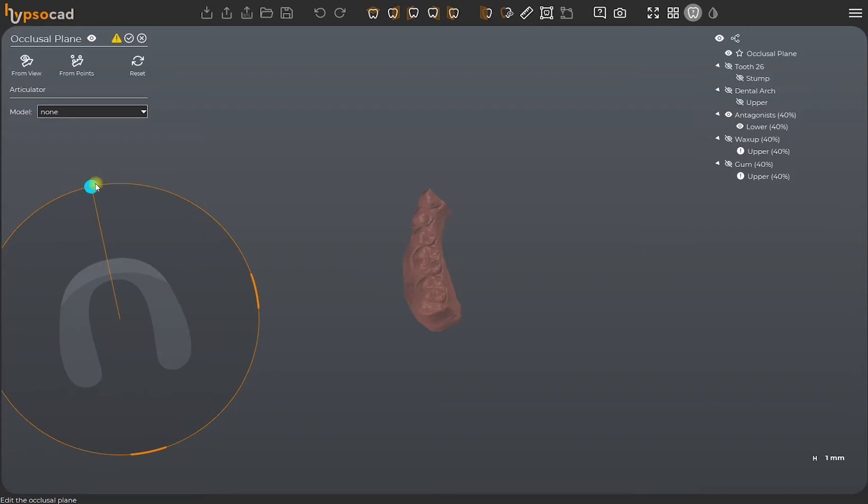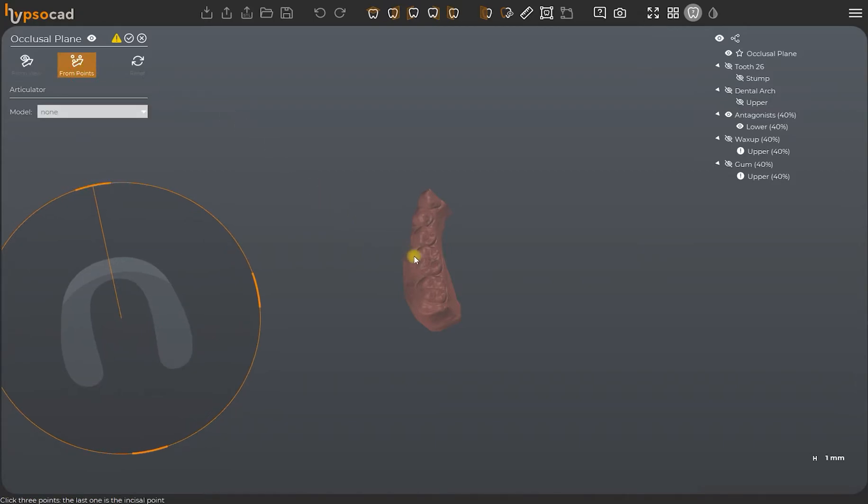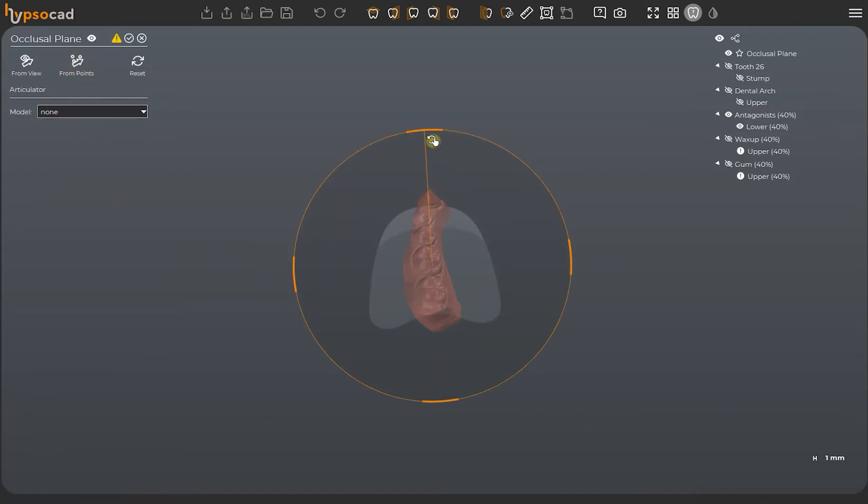Thanks to the tool from points, we can automatically find the right positioning of the occlusal plane. To use this tool, simply activate one of the two arches viewed from above. At this point, the software will be able to recognize the inclination of your restoration in just three clicks. The first two clicks should be on the outer molars and the third one between the incisors.